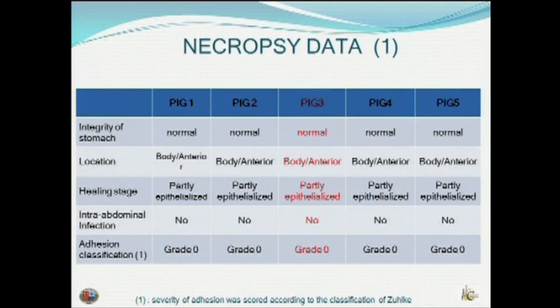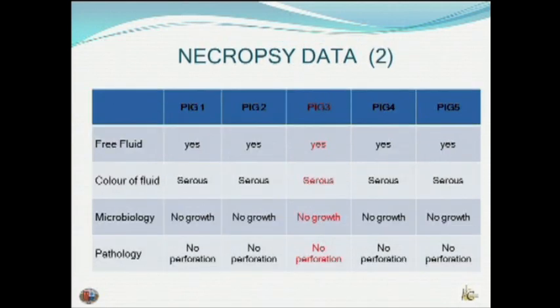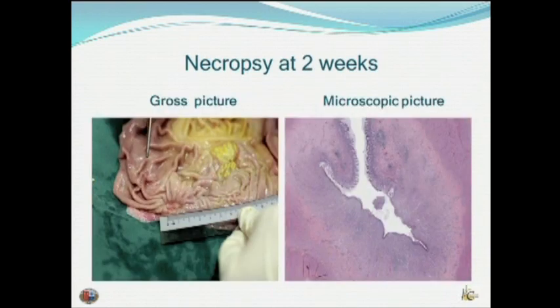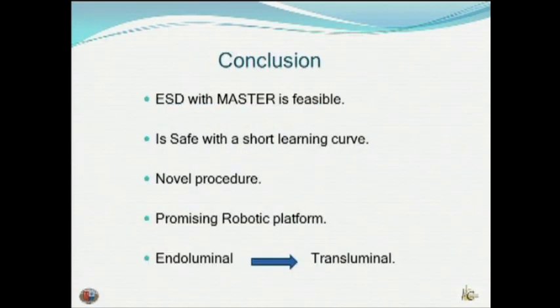There was no intra-abdominal infection or any adhesions at the necropsy. There was some free fluid which was sent for microbiological examination, which showed no growth. The stomach was explanted and sent for histopathological examination, which showed normal healing. This is the gastroscopic picture at the end of the procedure and at the end of 2 weeks, where we can compare the healing size. This is the gross picture of the explanted stomach specimen and the microscopic picture.